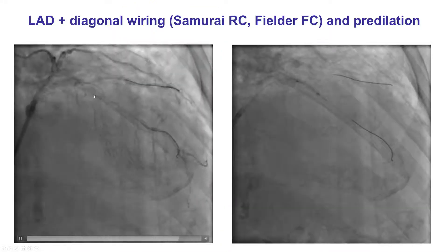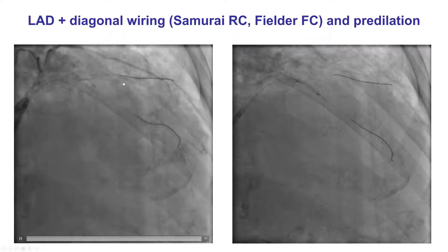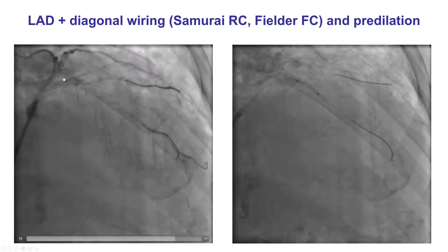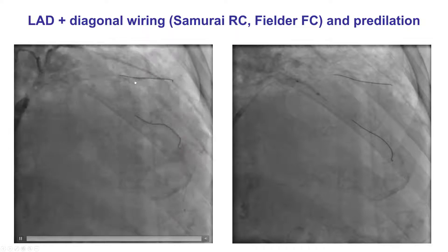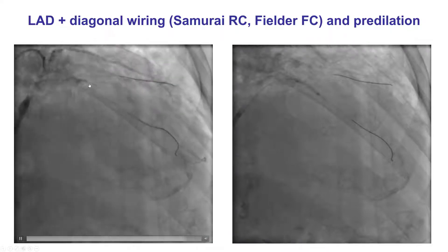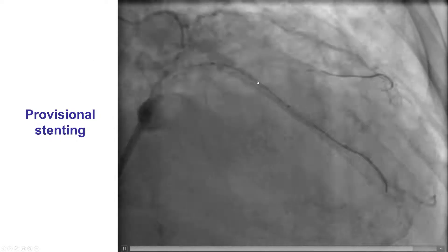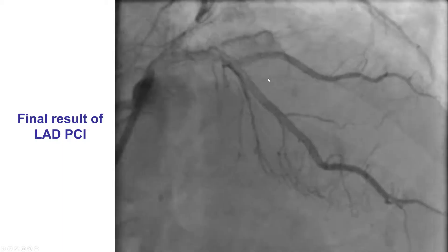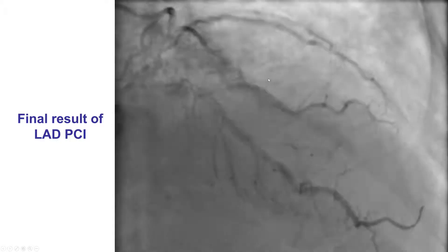In this particular case, we thought that the chance of occlusion of that diagonal branch, which was of decent size, was low. Therefore, we decided to do provisional stenting, having a guide wire in the diagonal in case that flow into it became compromised after stenting of the LAD. We went ahead and placed a stent jailing the diagonal branch, which caused pinching of the ostium. We rewired the diagonal branch with another guide wire and then did a kissing balloon inflation, providing a nice result with TIMI-3 flow in both the LAD and the first diagonal branch.